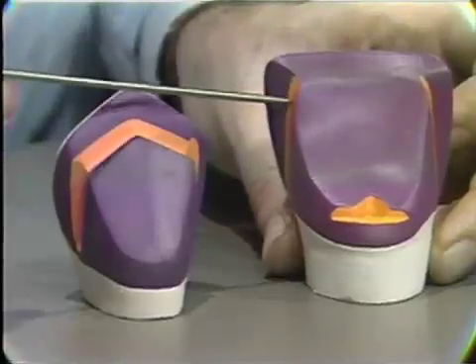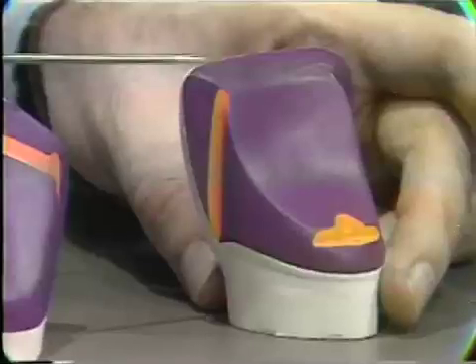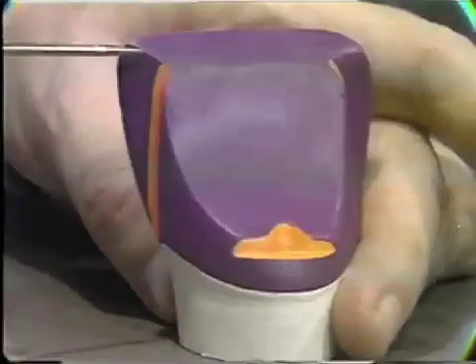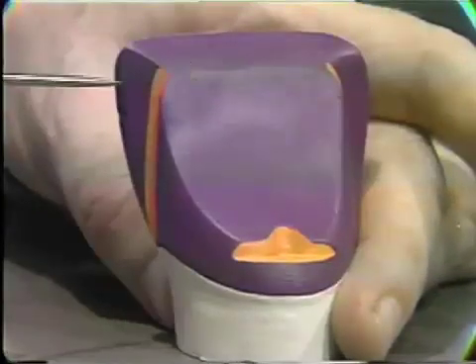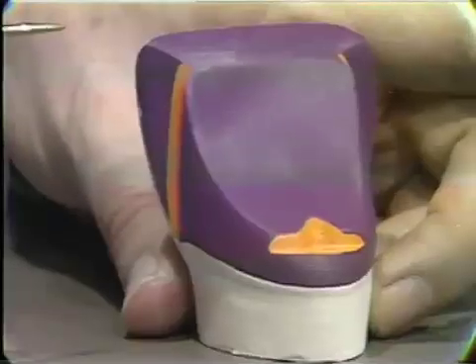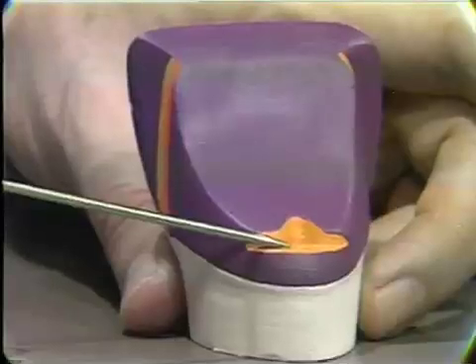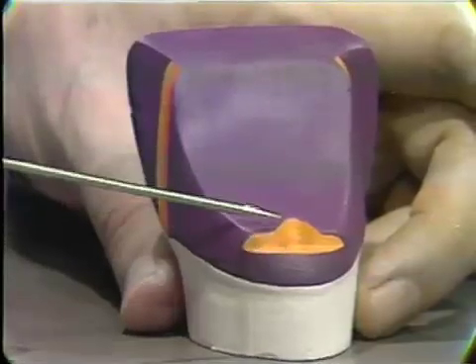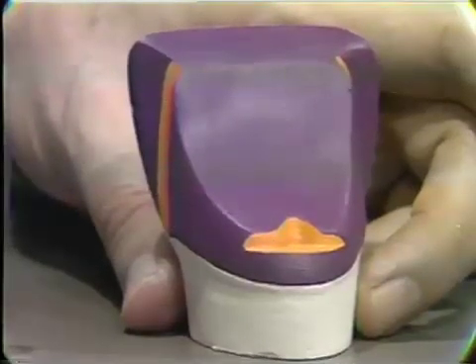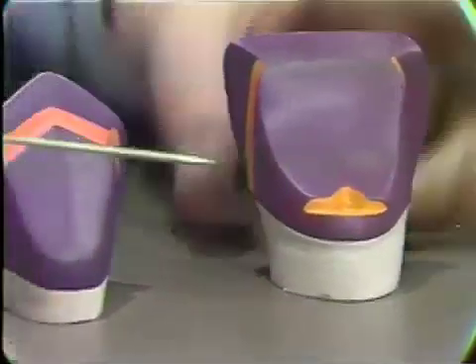This is a modification of the three-quarter crown used on a central incisor, particularly where there's a thin incisal edge and there's not enough room to cut a groove across here. This one, as you can see, has only proximal grooves on the mesial and distal. And in this case, it's certainly desirable to have added retention here. But by and large, in bridge work, we would always place a cingulum pin. If it's a single restoration, it isn't necessary, of course, to do that.